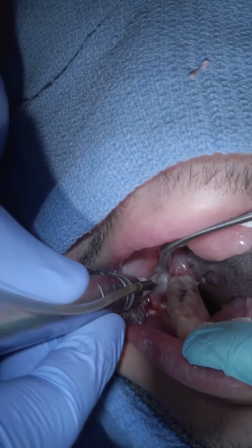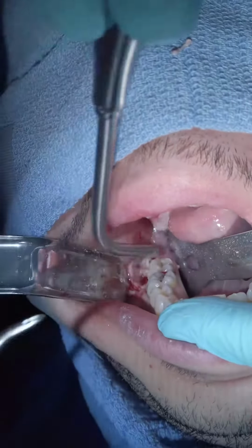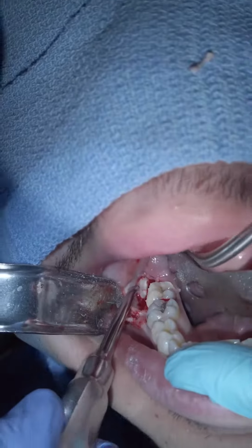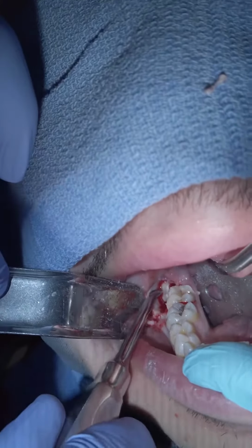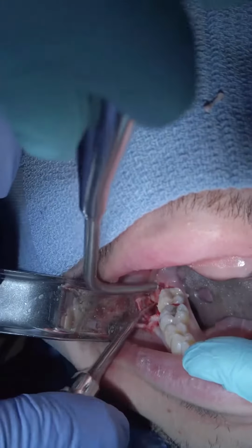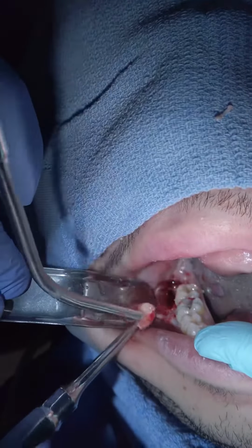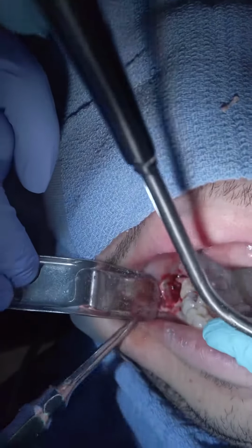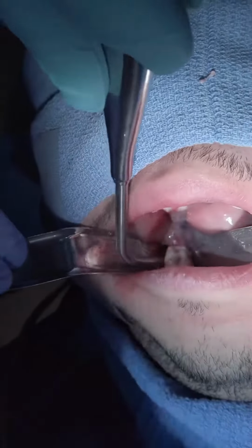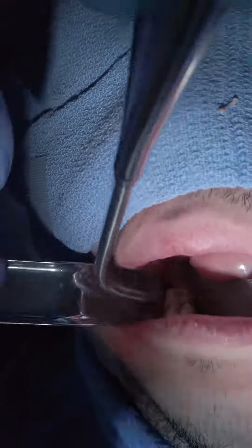So look what I'm doing. I'm just doing a little hole right there. See my B elevator? See that's going to fit in that little groove? And then we're going to go for, look, split that. Look at that. We got both the roots right there for us. Okay, Mel? All right, there's our roots. And then we're going to go in here, do a little irrigation in there, and we're going to be done.